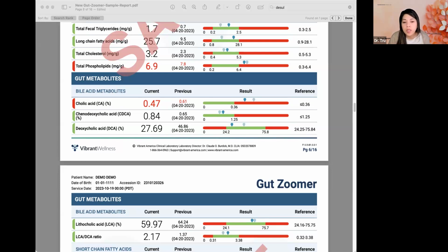Another thing you want to consider here, in learning how to interpret this, is that when you see elevated secondary bile acids in the colon or the stool, there are other things they are associated with clinically, which is increased oxidative stress, which is like rusting of the cell, right? DNA damage, impaired gallbladder function, gallstone formation, colonic inflammation, and increased intestinal permeability or leaky gut.